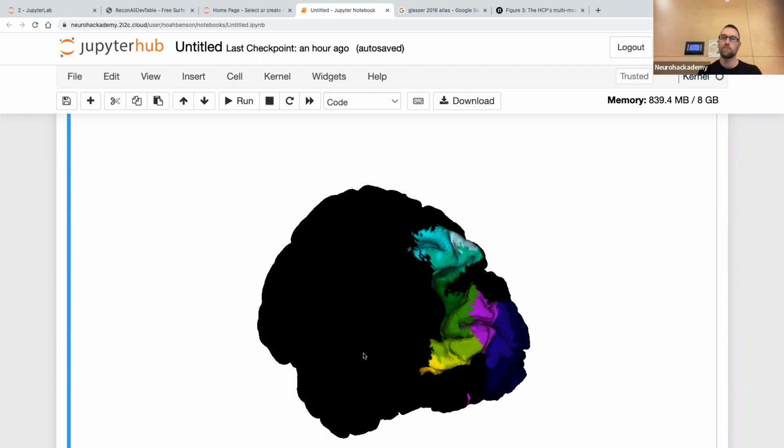In particular, that can be problematic volumetrically because you might have a voxel with a very strong signal next to one with a very poor signal, or that's not really even in the brain or not gray matter. When you interpolate, you might get some of that white matter and some of that gray matter, and you'll get a weird signal as a result.